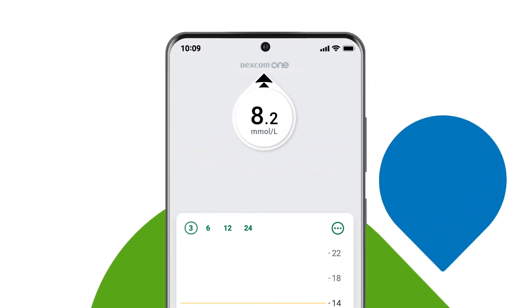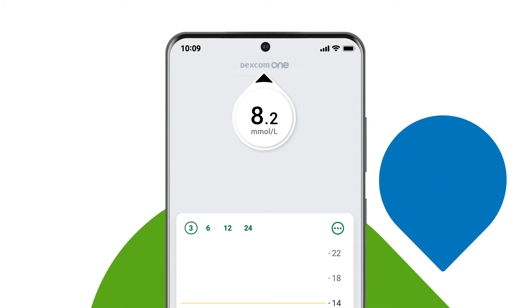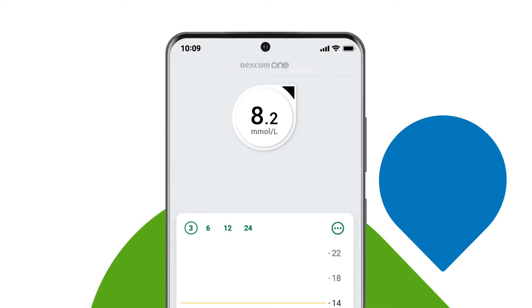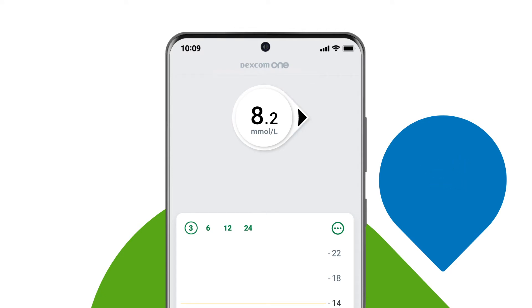See the double arrows pointing up? That means your glucose is rapidly rising. One arrow pointing up means your levels are rising but not as fast. An arrow angled up means you are slowly rising. An arrow to the side means your glucose levels are steady.